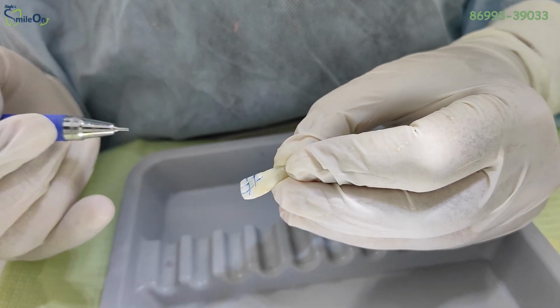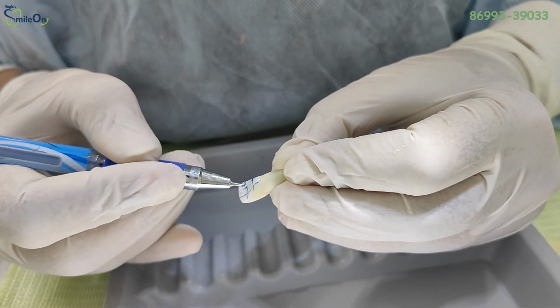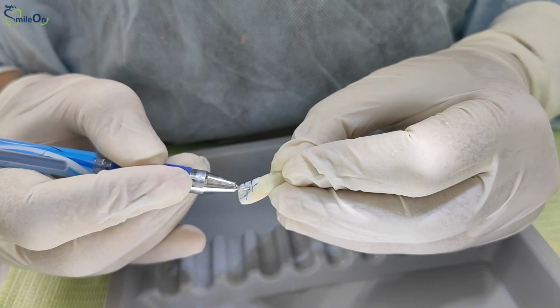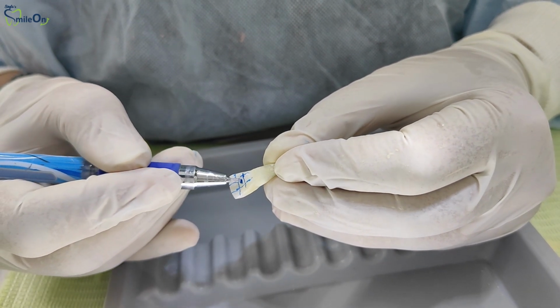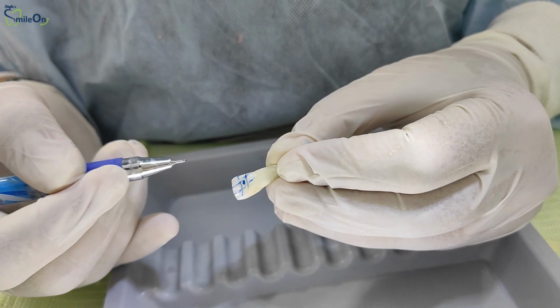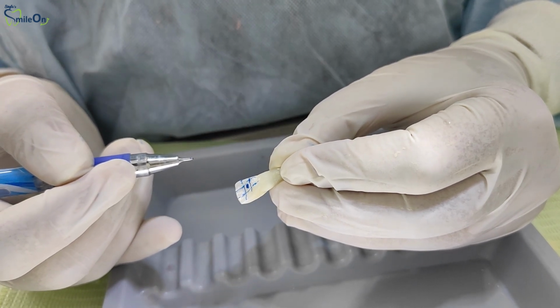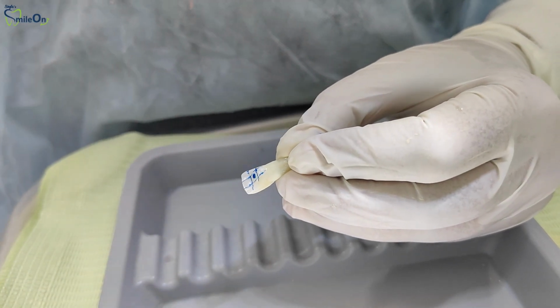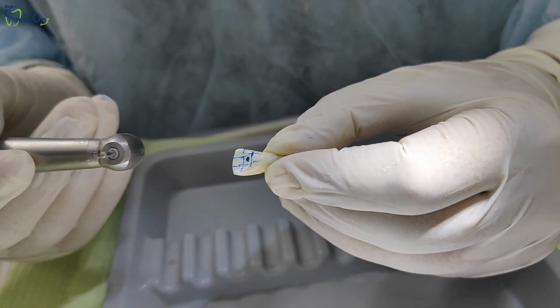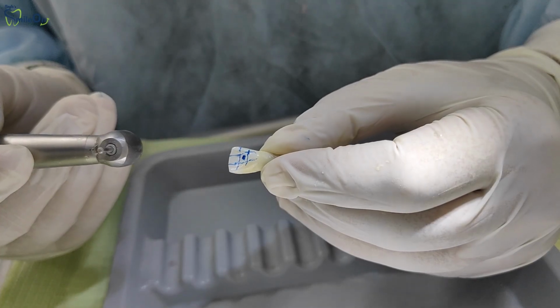Now our point for the burr should be the center part of this grid. So basically this point should be the start point where we have to place the burr for access. Now we are going to start the access preparation. The first burr which we have to use for access should be a round burr.